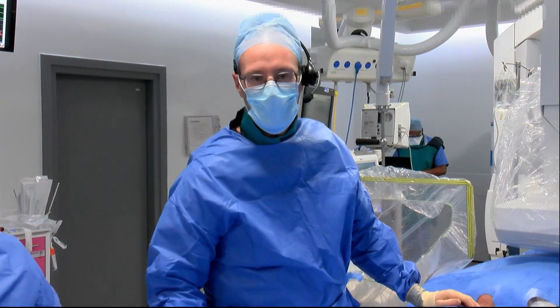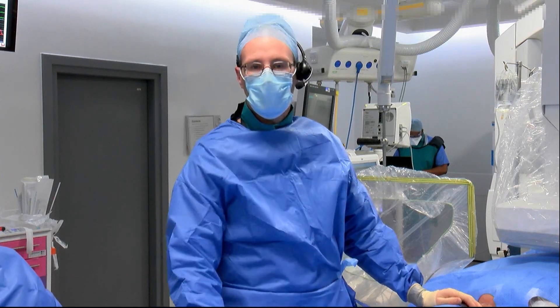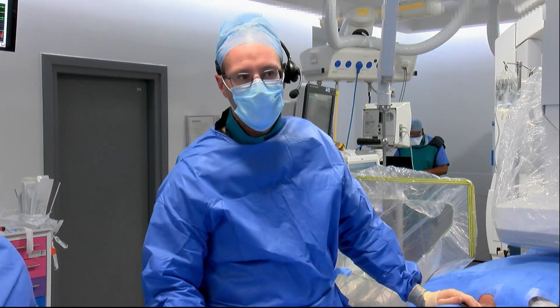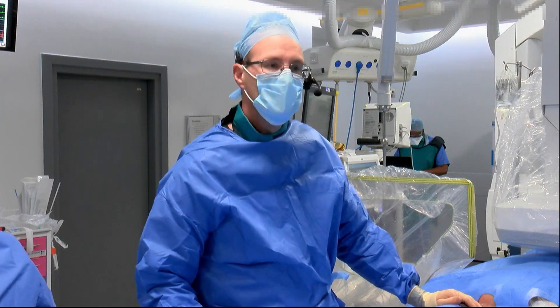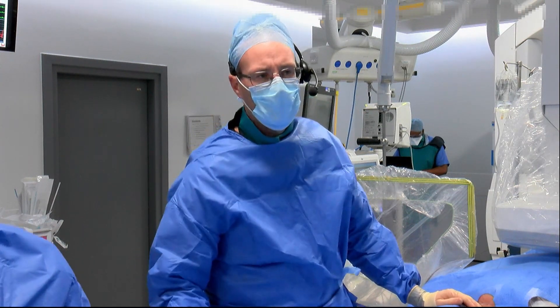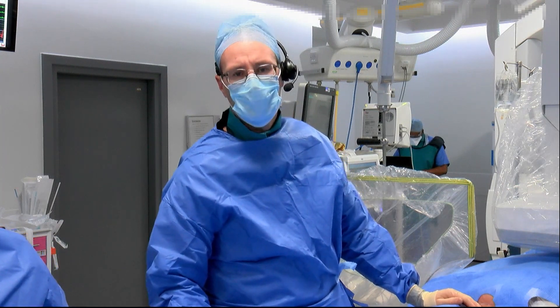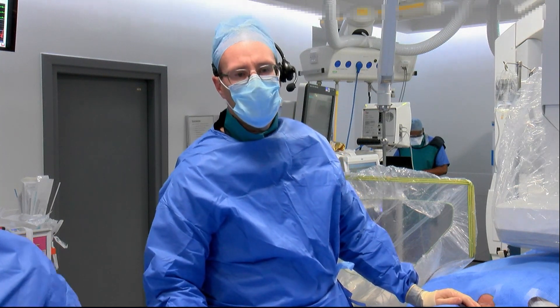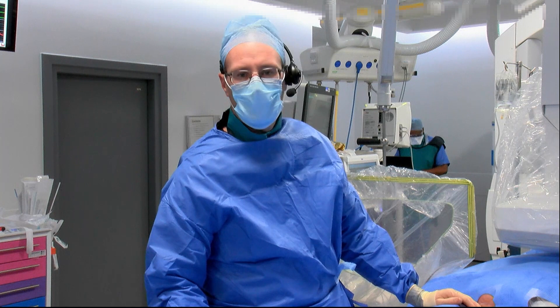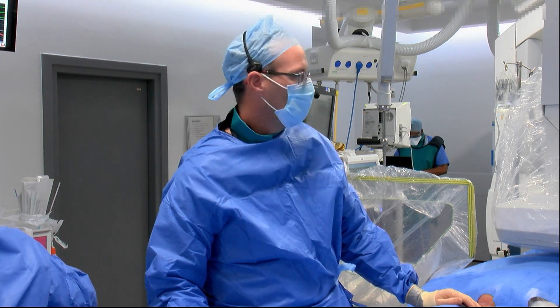This is a 51-year-old lady that presents with exertional dyspnea. She was found on transthoracic echocardiography to have a moderate to large secundum atrial septal defect. She underwent an MRI because the transthoracic echocardiogram suggested elevated right heart pressures and was found to have a 2-to-1 shunt through the ASD. She's therefore come to the lab today for closure.